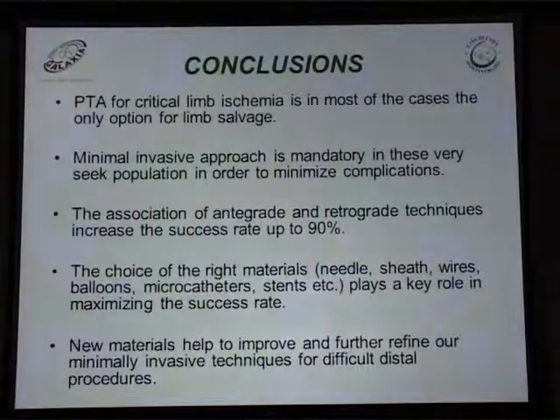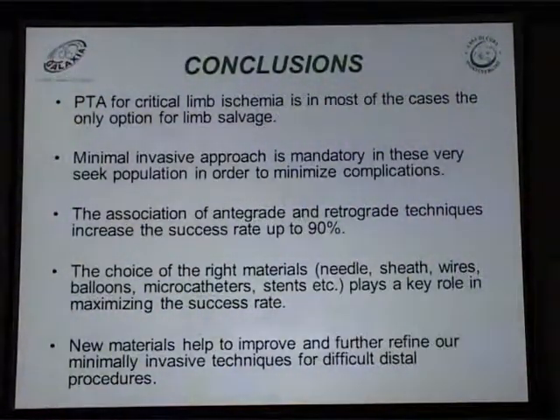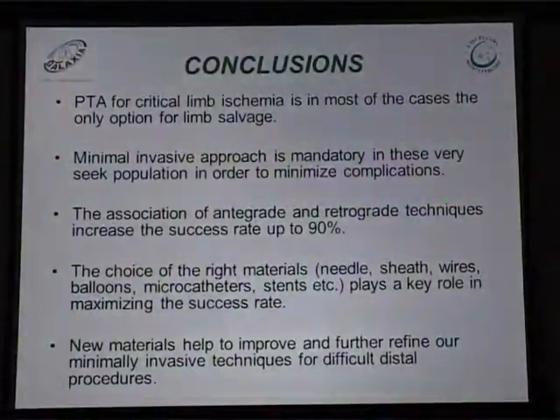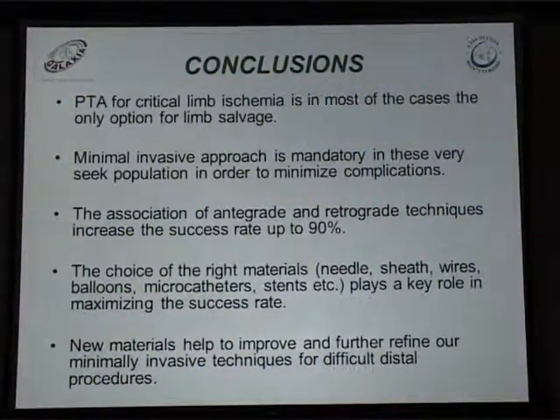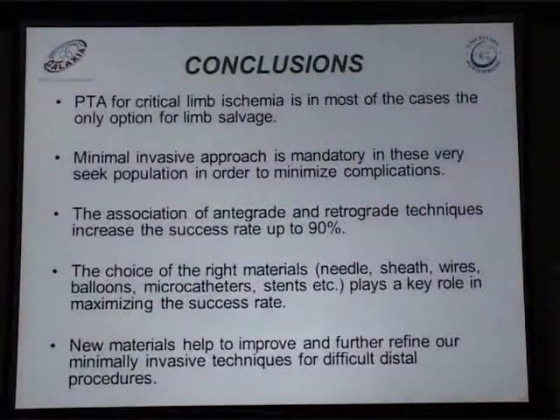Angioplasty for critical limb ischemia is in most cases the only option for limb salvage due to high morbidity of this kind of patients. A minimally invasive approach is mandatory in this very sick population in order to minimize complications. The association of antegrade and retrograde techniques increases the success rate up to 90%. The choice of the right materials plays a key role in maximizing the success rate. The new materials help to improve and further refine our minimally invasive techniques for difficult distal procedures.